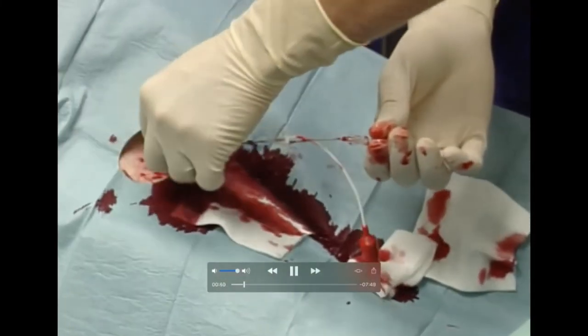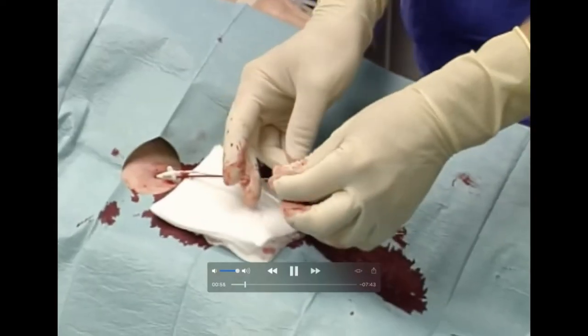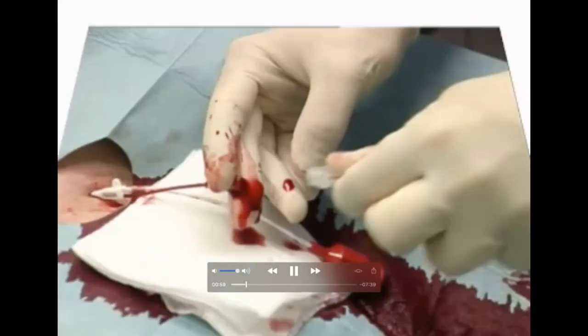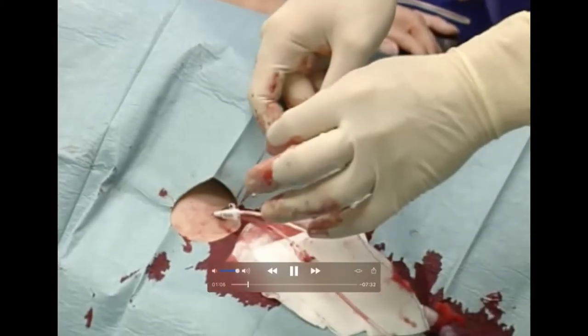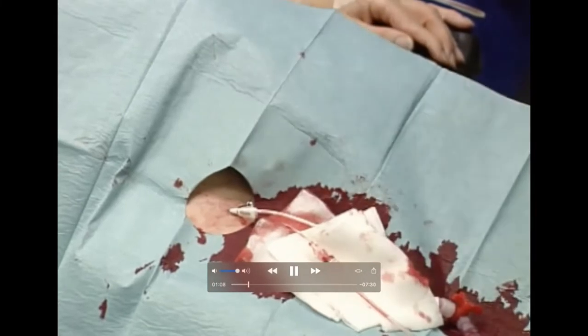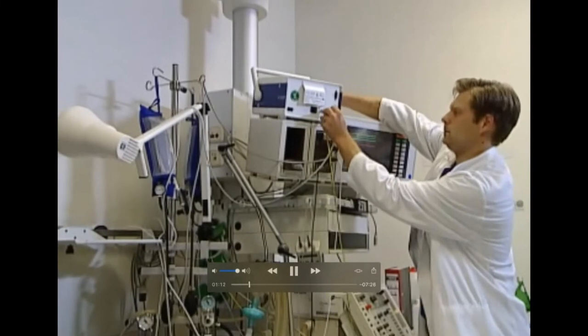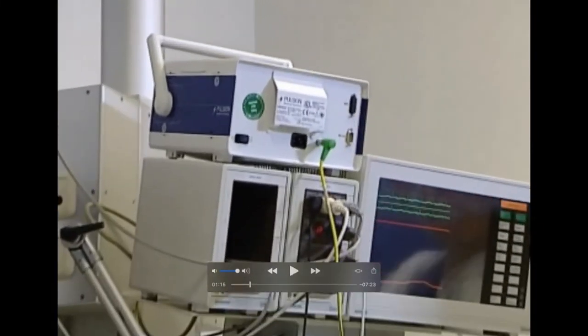The catheter can now be inserted into the vessel over the guide wire. Hold the catheter at the desired position and withdraw the guide wire. Connect the already flushed, air-free arterial pressure line to the catheter and secure the catheter to the patient using the suture rings. Connect the grounding cable to the connector at the rear panel of the PiCCO. So that is how you insert the femoral arterial catheter, as you all could see.